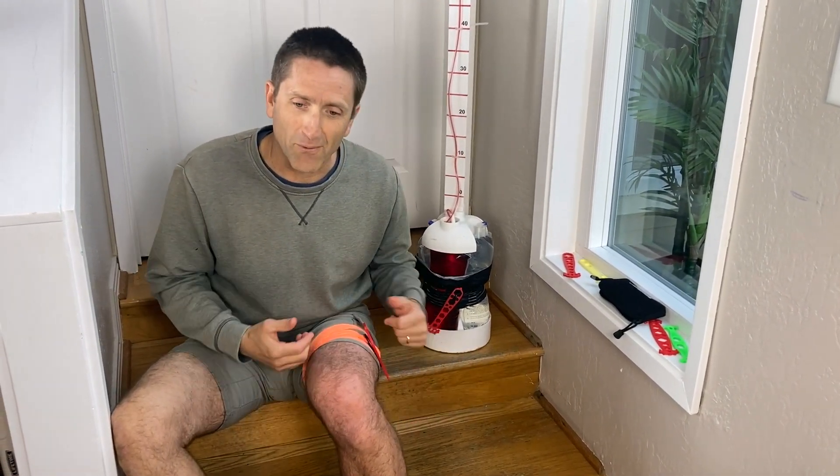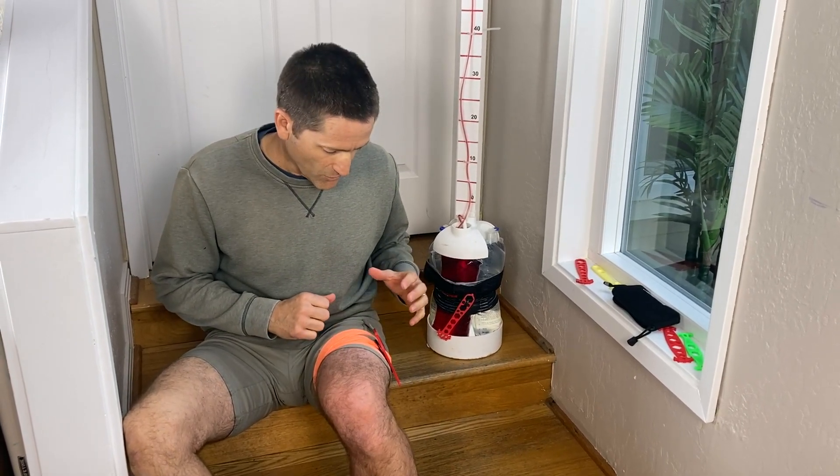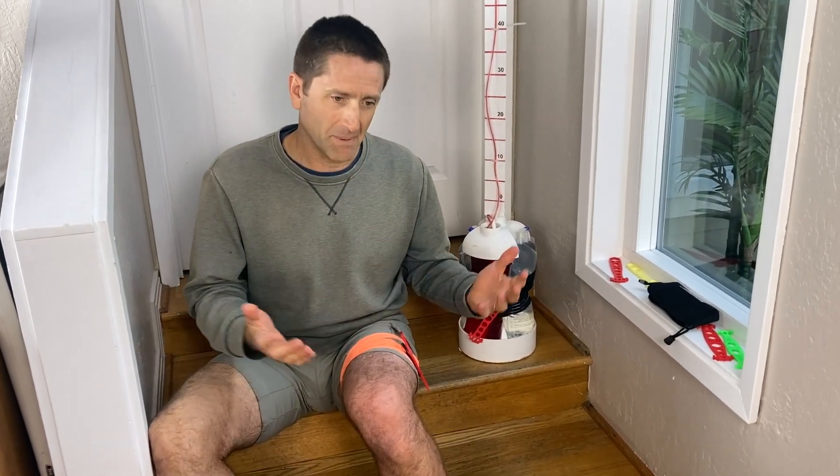I can feel blood flow back in my leg again. I think this is a nice approach for large limbs and just a better way to deal with bleeding. Because you have more mechanical advantage, there's less stress on the windlass itself, so it's less likely to break. Anyway, hopefully these will serve you well. Bye.